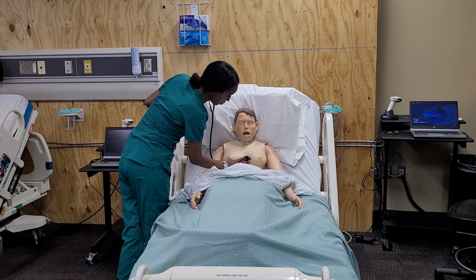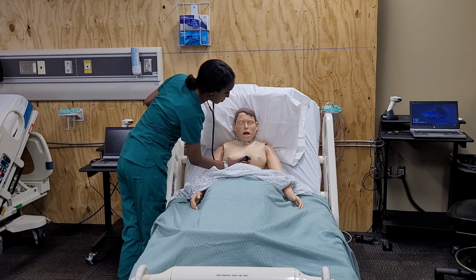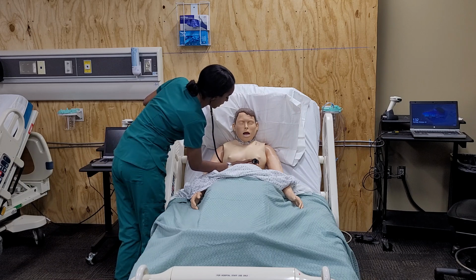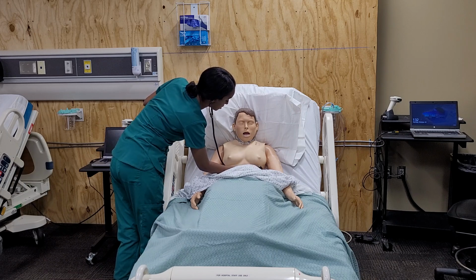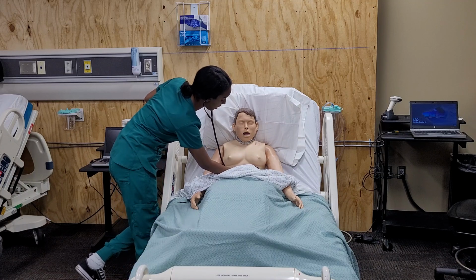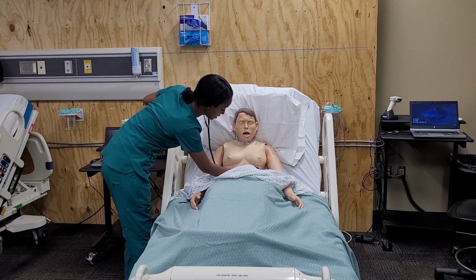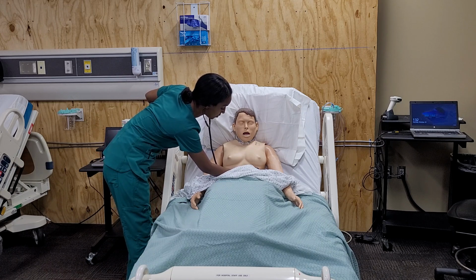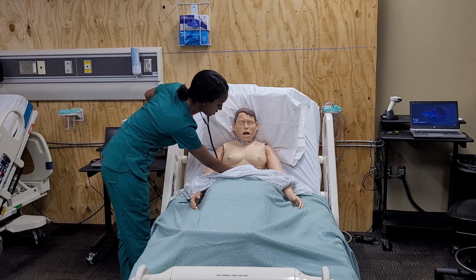Left side, fourth intercostal space left of the sternal border. And then fifth intercostal space, mid-clavicular line. I'm going to listen to the apical pulse for 1 full minute.